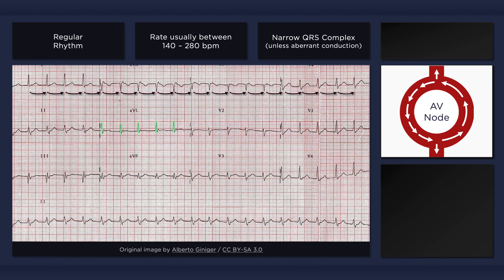Putting all of that together, we could thus far describe our findings on the ECG as a fast regular rhythm with a narrow QRS complex — all typical features of a supraventricular tachycardia.